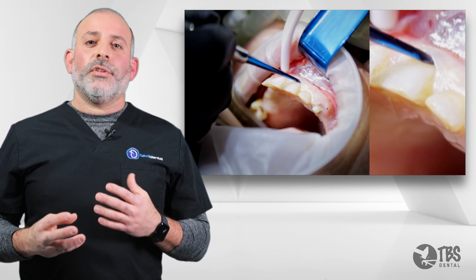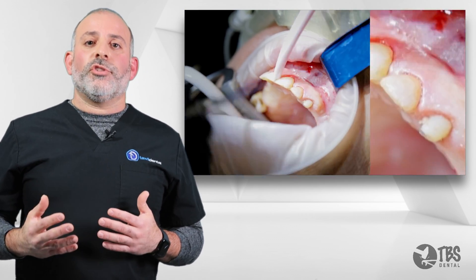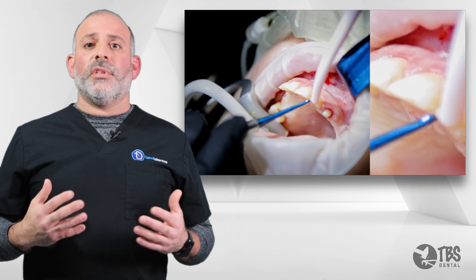The first step that we're going to try to do is to separate that periodontal ligament. We can use a boozer instrument for this to be able to walk around and separate it from all different aspects, to ensure that the tissue is not attached to the tooth.